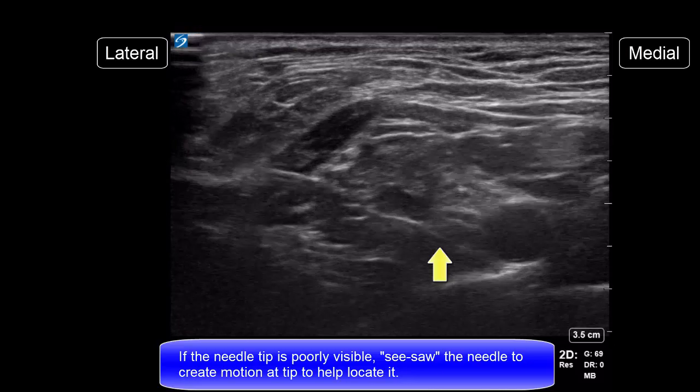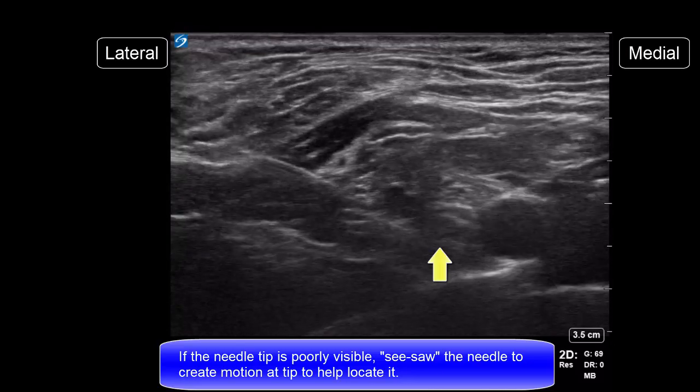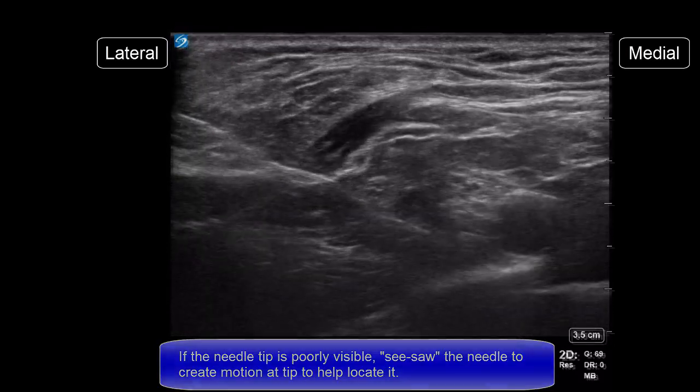If the needle tip is poorly visible, use see-sawing motions to create motion at the actual tip that will help locate it.